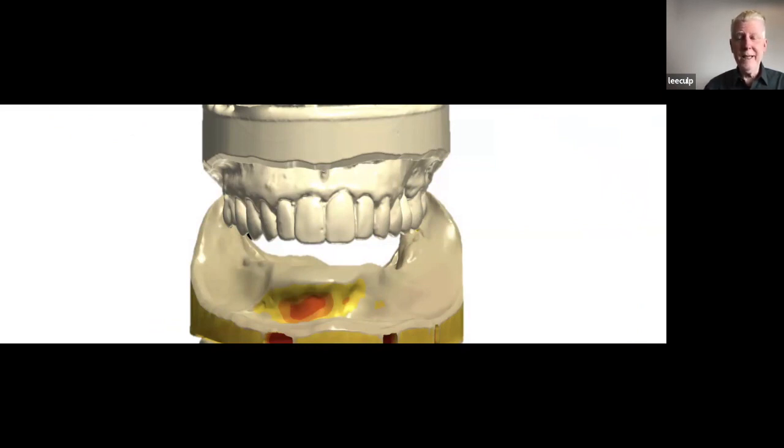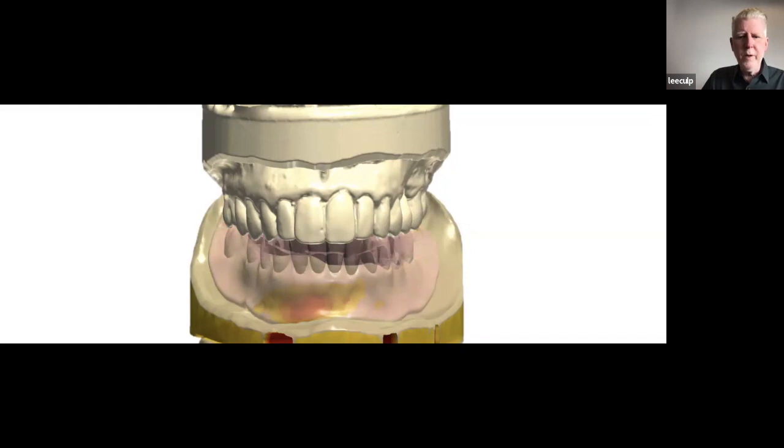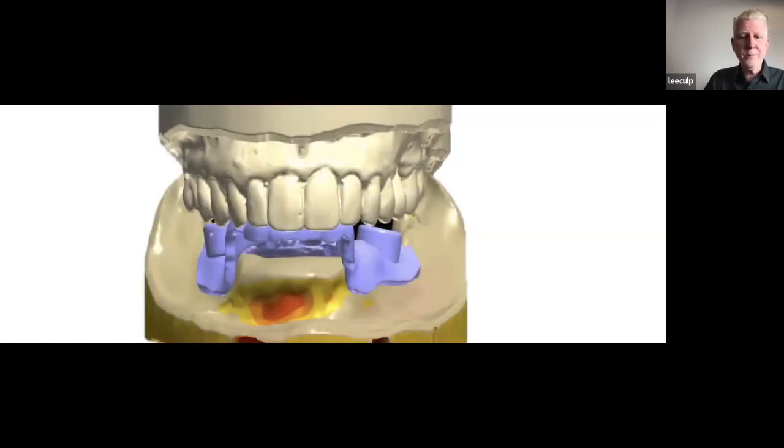We definitely need to even it up, but it's more of a recontouring than flapping tissue with a bone reduction guide and foundation guide, because that's a very invasive surgery. So we're able to see this before we even started. And this goes back to the power of what we do with digital dentistry. We know what we're going to get into, good or bad, before we ever get into it.